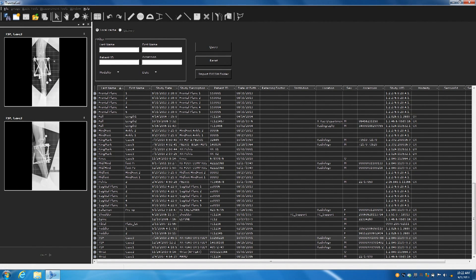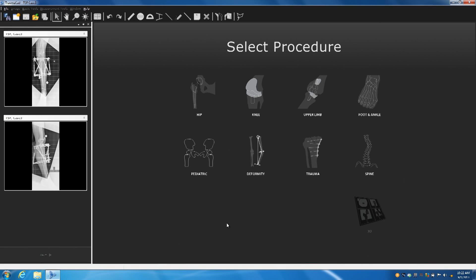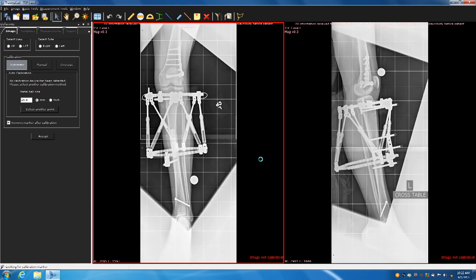So at this point, just click each image, hit next, go to deformity, and it automatically throws you in. This is very important for calibration — you're telling the computer exactly where things are, and it's going to calculate some parameters for you. Select the first one, select AP, select right. It doesn't find the little mag ball, so hit manual.